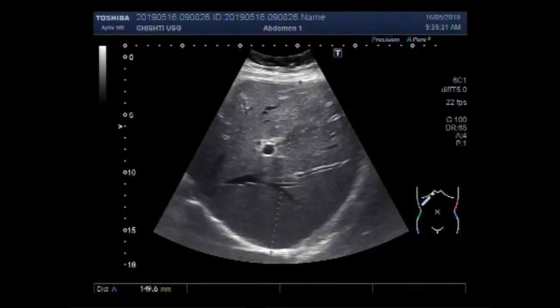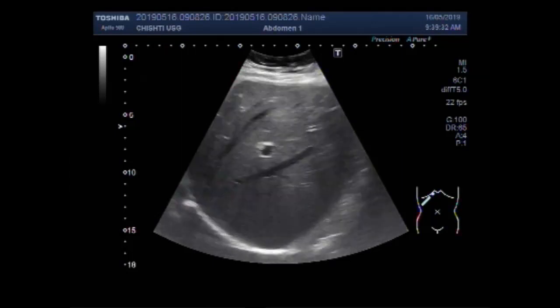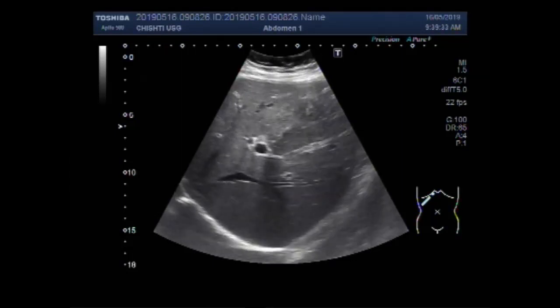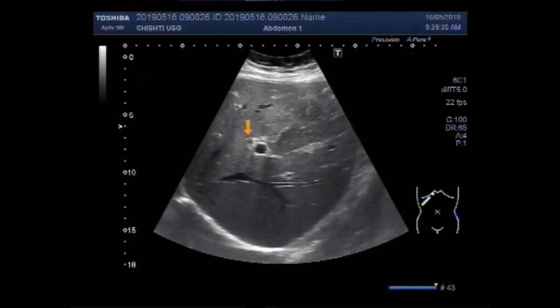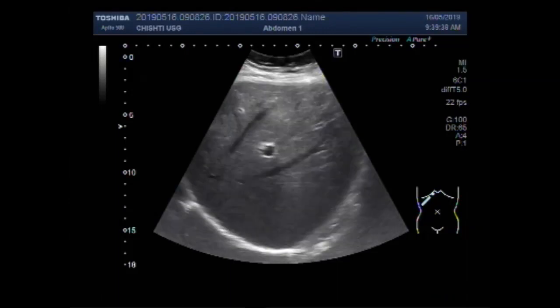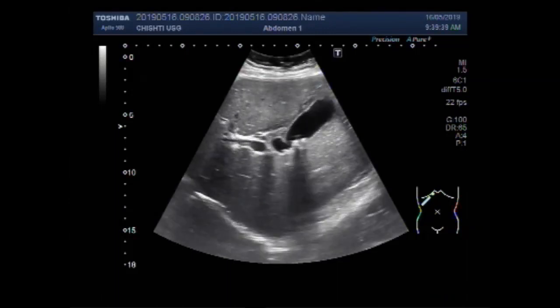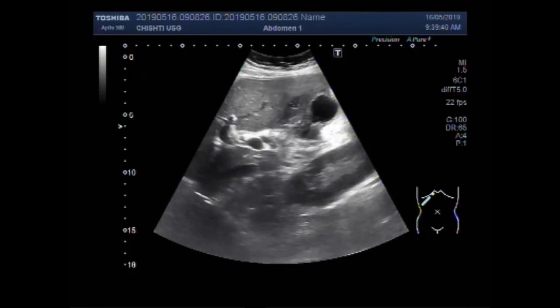You can see the liver is of normal size, about 15 centimeters in the long axis. This is the liver and this is the gallbladder.